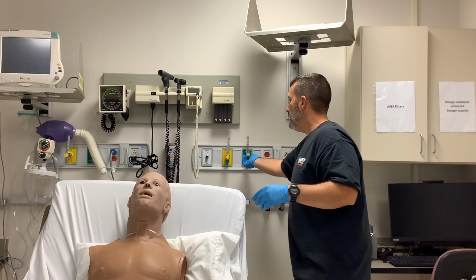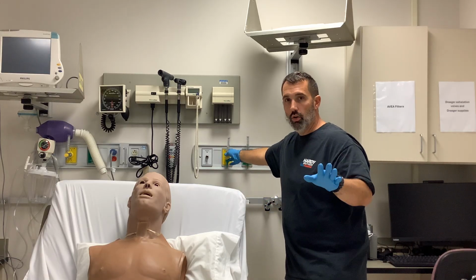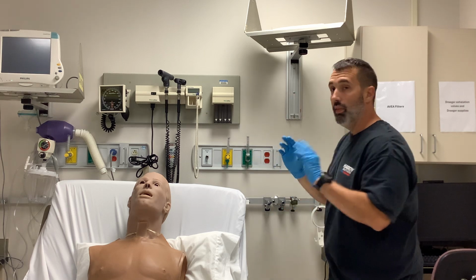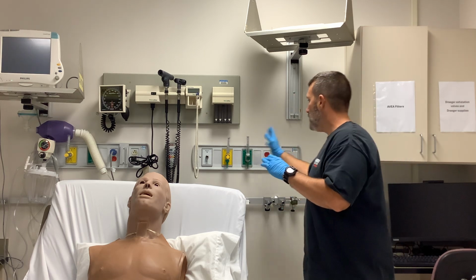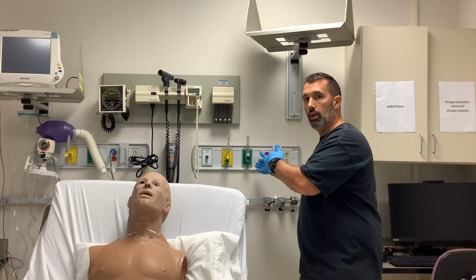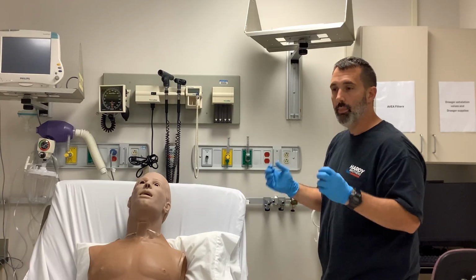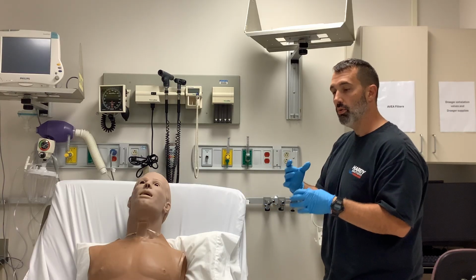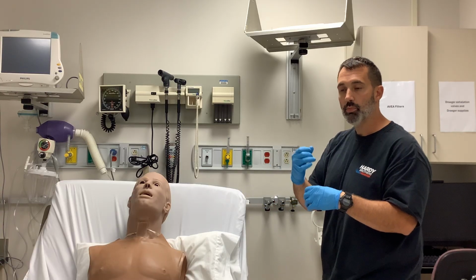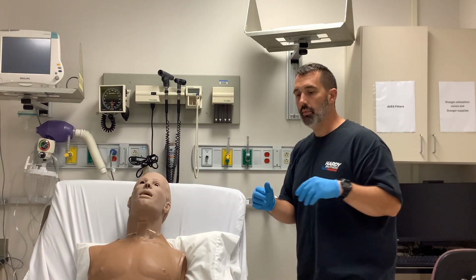So then, that being said, the FdO2 from the air flow meter is 0.21. The FdO2 from the oxygen flow meter is 1.0. It's 100%, 21%, 100%. The difference is, are we meeting or exceeding the patient's peak inspiratory flow demand, and are we utilizing a device that we can set a specific inspired amount of oxygen, and then we go from there.